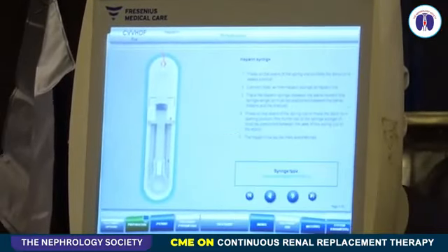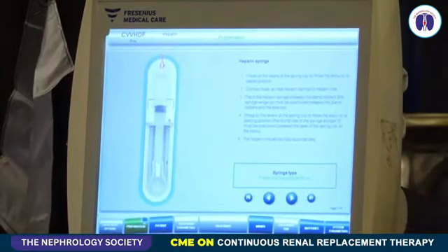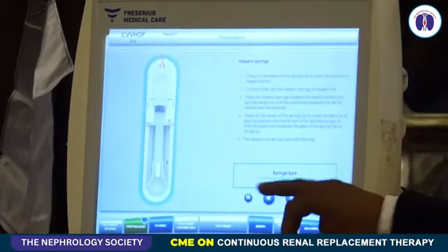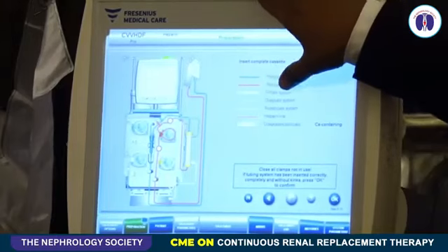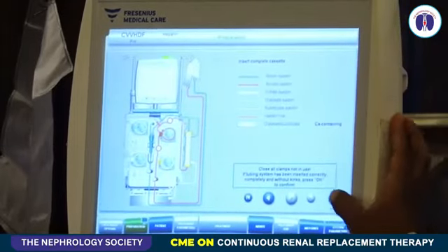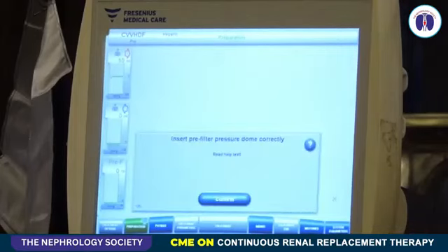And this is heparin. 90% of CRRT patients, we basically keep heparin free. If we want to keep low heparin or with heparin, this is the heparin line, we can place it via this heparin pump. The dose of heparin you can set from there. We'll show you afterward. And this is the entire circuit with the color-coded graph. You can see this is the blue one: this arterial, the access pressure, filtrate pressure, dialysate, substitute, heparin. And color-coded you will see. Let me say OK. And once I say OK, the machine will automatically take the things out.